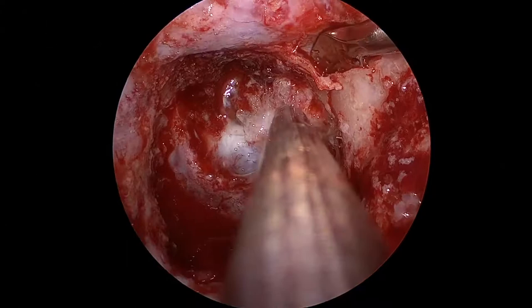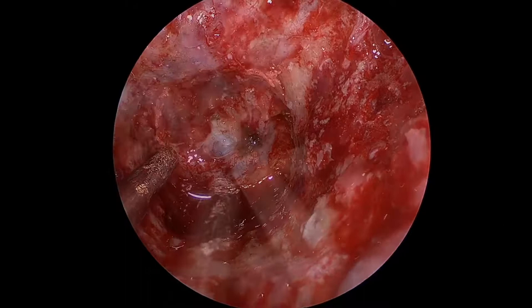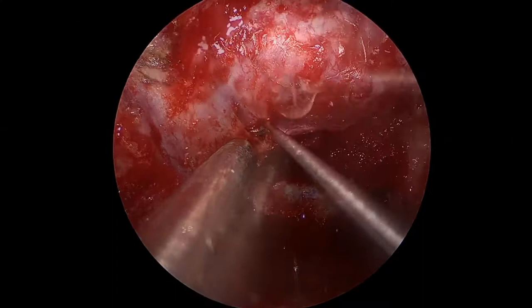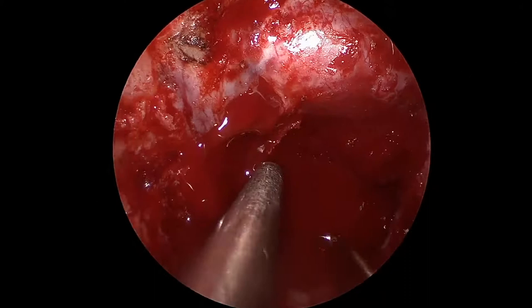I'm now getting a good margin inferiorly to make sure that it's all clean of tumor. Now we're working on removing the posterior clinoids on both sides as well as the dorsum sella. We are dopplering the anterior wall of the cavernous sinus so we can directly incise the anterior wall without injuring the carotid artery. Once we open the anterior wall of the cavernous sinus, we obtain significant venous bleeding.